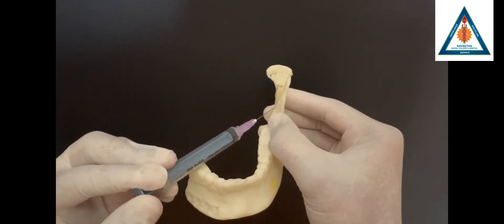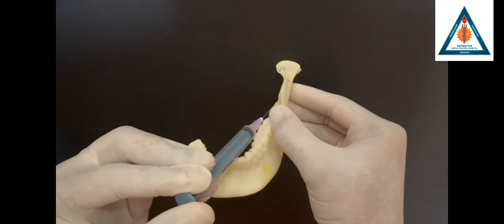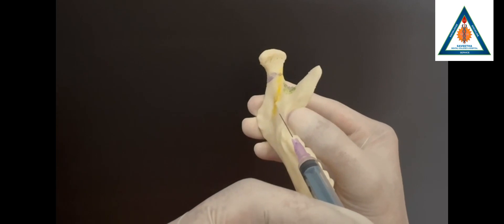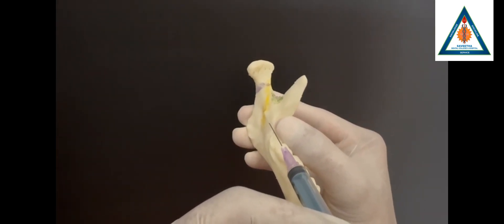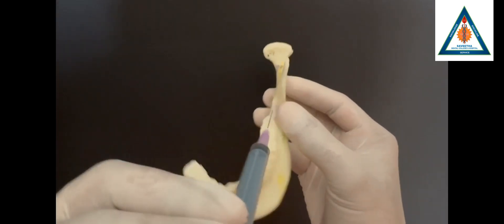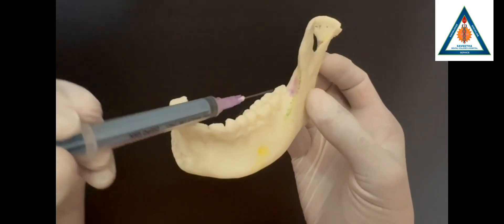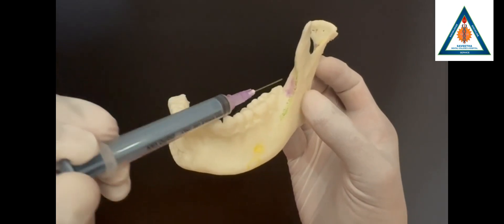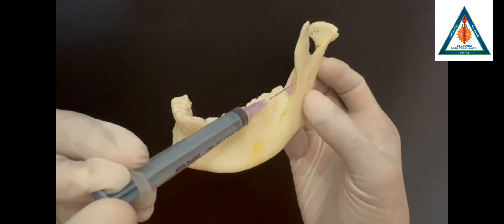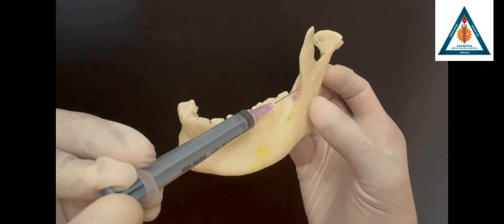Once you give the inferior alveolar nerve block, come back to the same side, retract the syringe halfway, and deliver around 0.5 to 0.8 ml of solution to anesthetize the lingual nerve. Once this is done, completely retract the syringe, then move distal to the last molar present. Feel the bone and deliver around 0.3 to 0.5 ml of solution to anesthetize the long buccal nerve block.